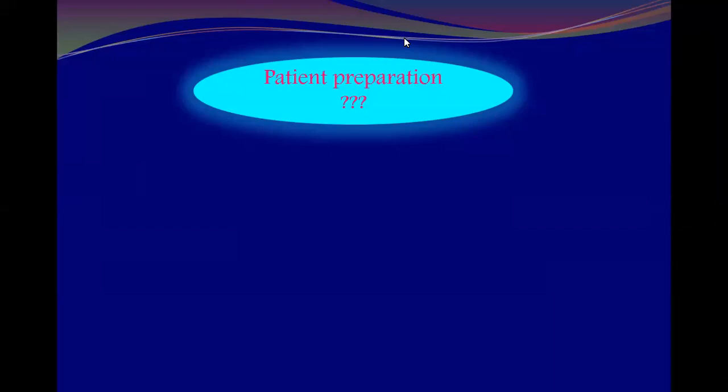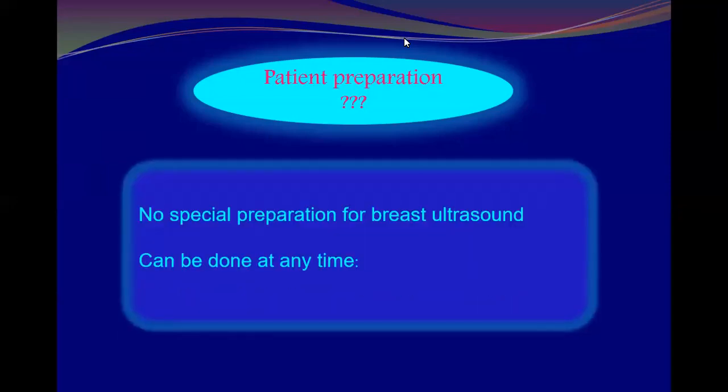Okay, but my question is specifically, like for ultrasound of the abdomen, we ask the patient before coming to us to fast. Any preparation for breast ultrasound? All your information is correct, but is there any preparation you have to do or make for the patient before coming for breast ultrasound? No, I don't think so. Excellent, well done. No special preparation for breast ultrasound, it can be done at any time.